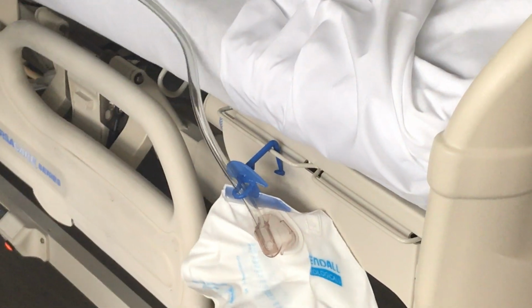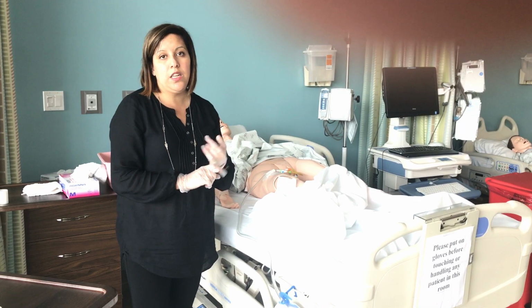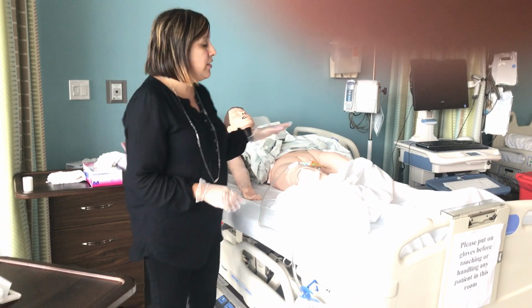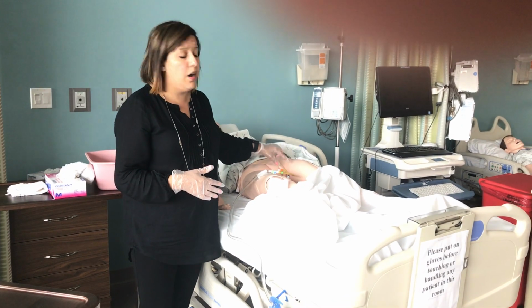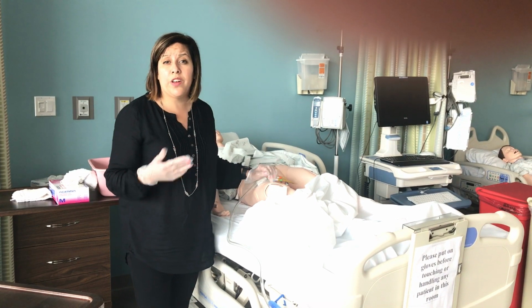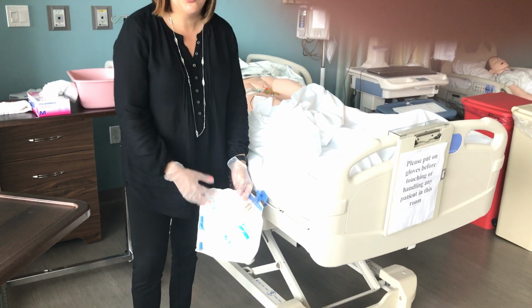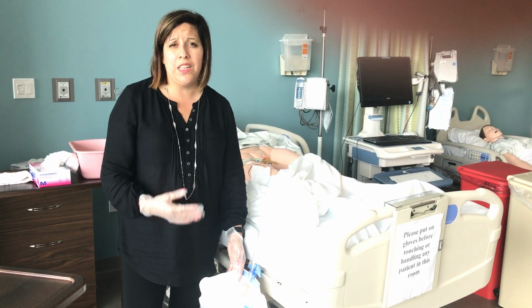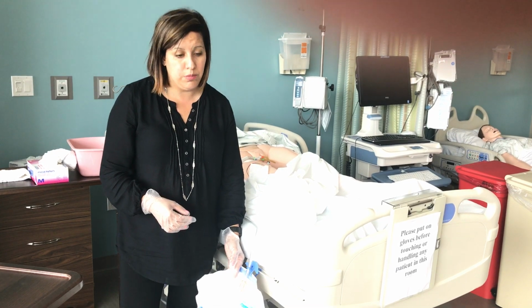As a CNA, it's very important when you're communicating with your patient that if they complain about any pain, burning, or irritation, you observe that when you're doing your pericare. If there is any irritation, secretions, or leakage, those are things you have to report to the nurse. You also have to report the color of the urine. It should be a straw color, clear. You should never see any remnants. It shouldn't be cloudy, and you shouldn't see any blood in the urine. If you do, you need to report that to the nurse immediately.